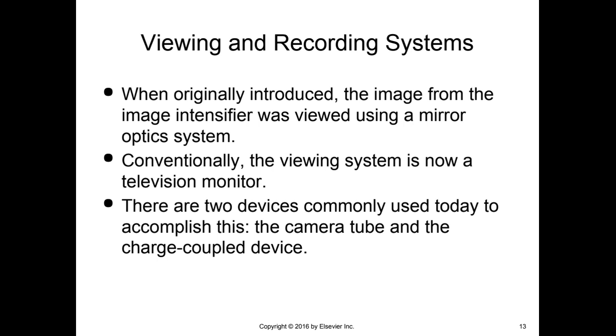I'm going to stop right here. I will pick back up on these before I go deeper into the viewing systems, where we're talking more about the camera features and also your CCDs, CMOSs, ADCs, etc. We're going to go into some of our Cloverleaf videos just to give you a visual. So I'll break right here and I'll bring it back to Cloverleaf.